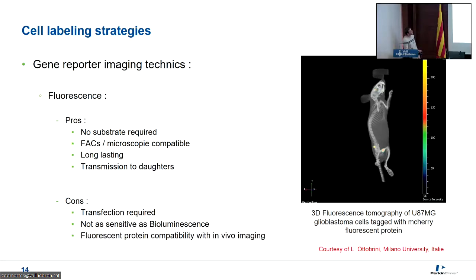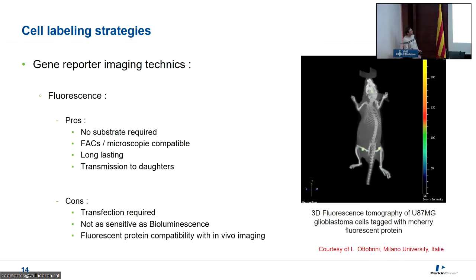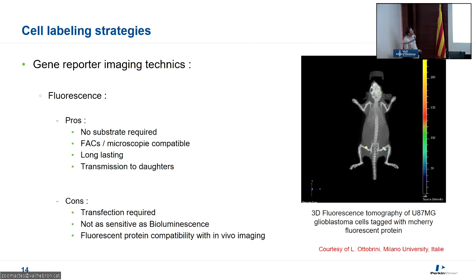This is just a measurement of 3 different implantations: subcutaneously, into the muscle, and orthotopically, because it's U87 glioblastoma cells. So just measured using 3D fluorescence. So you can see the X-ray to get the anatomical map, and we see the localization of those tumor cells in 3 different locations.